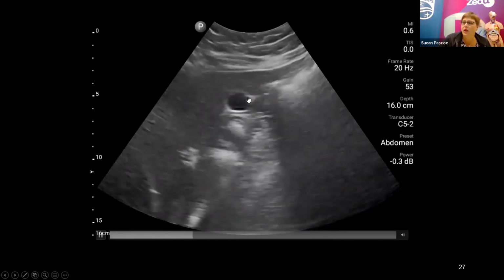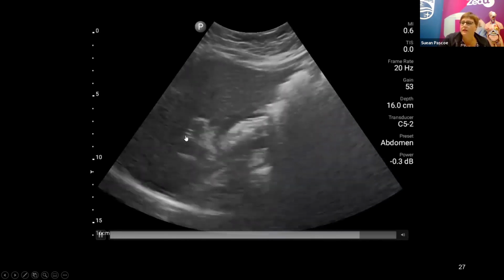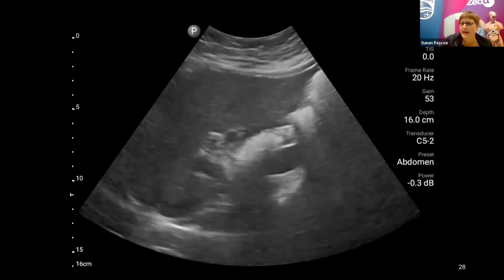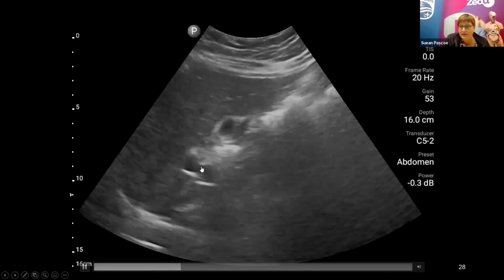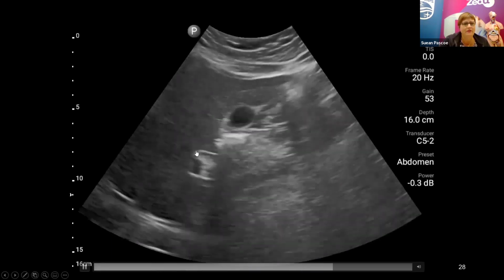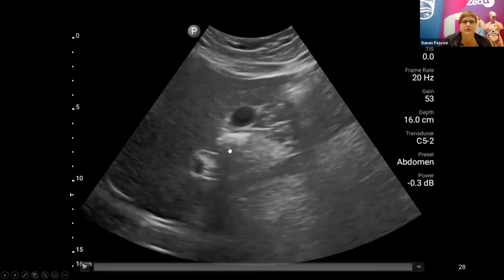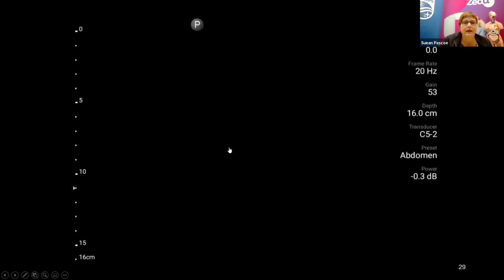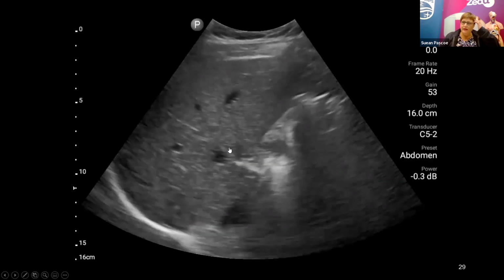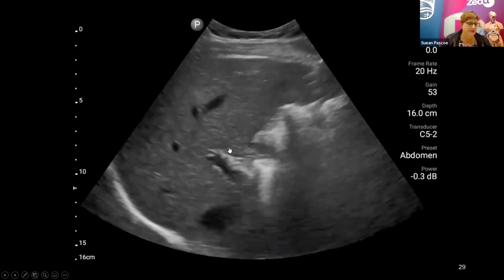Now, the first thing I was looking at up here, he's got quite a long neck of the gallbladder, and then we come back over to find the portal vein, and it's not so easy on Mike, and he looks like he should be easy. So in this one, we are just seeing a little bit of it here. It's very, very skinny, but the bowel gas just here is also getting in the road. Even though this was really quite challenging on Mike, it didn't matter if we rolled him on his side or not.